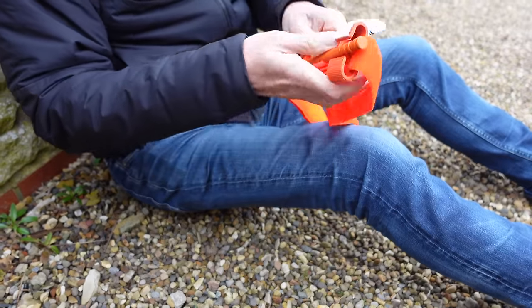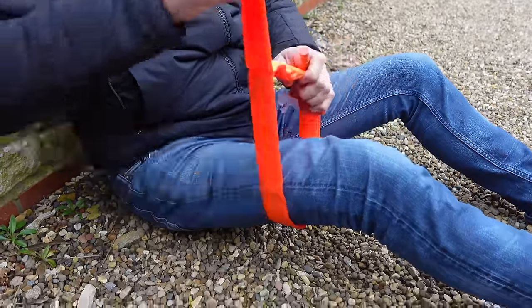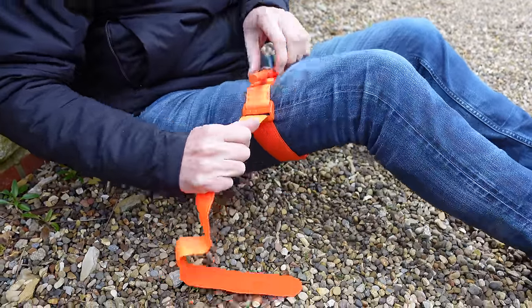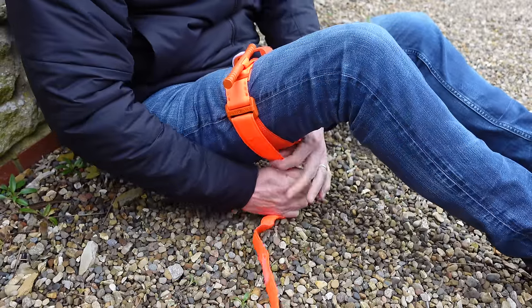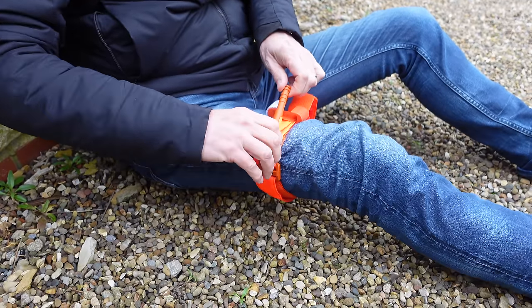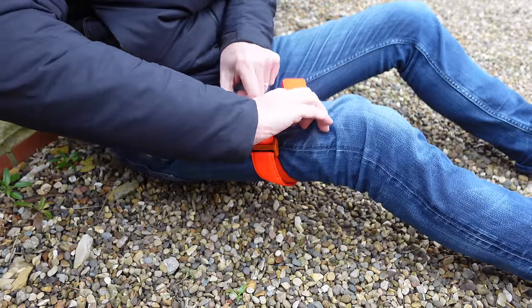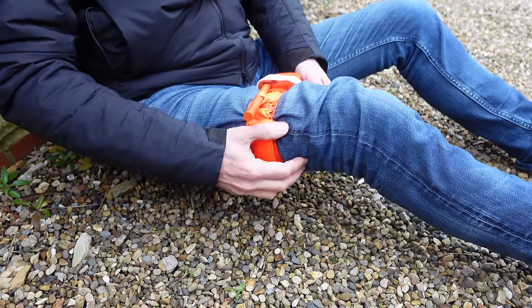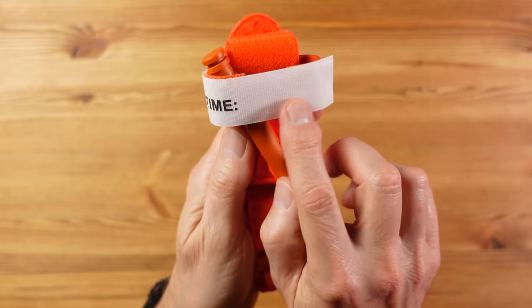It works like this. Just pull open the tourniquet, which is held together with velcro, and you can see this can be easily self-applied — that's one of the benefits of this type. Apply the tourniquet two to three inches above the wound, avoiding knee and elbow joints, and pull it tight enough on the velcro so that three fingers cannot fit underneath. Then you turn this rod here, called the windlass, which provides a leverage force to increase restriction on the limb — you turn that until the bleeding stops. Then you secure the rod in the plastic clip, pull the velcro across to make sure it doesn't slip out. There's also a place here to make a note of the time so a medical professional can see how long it's been applied.